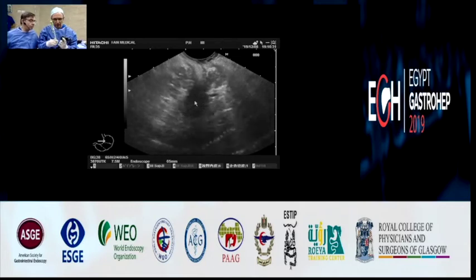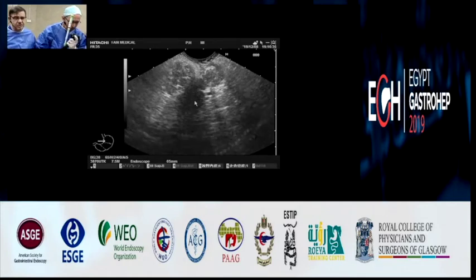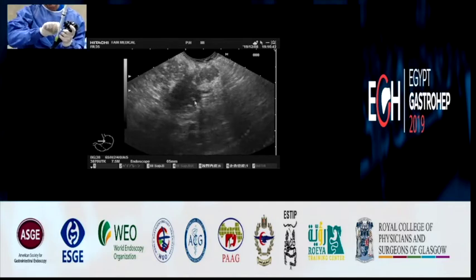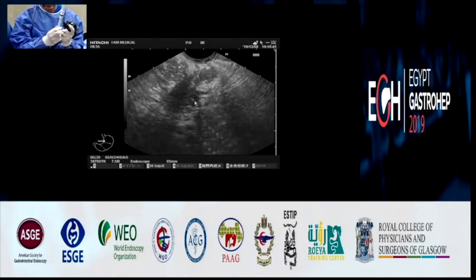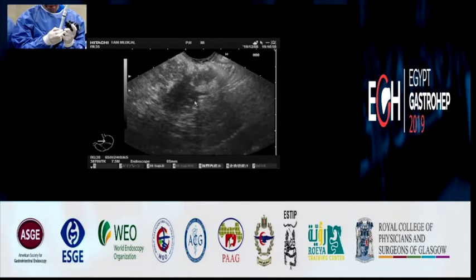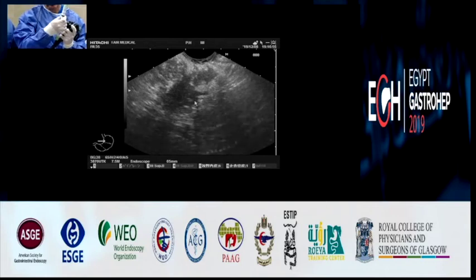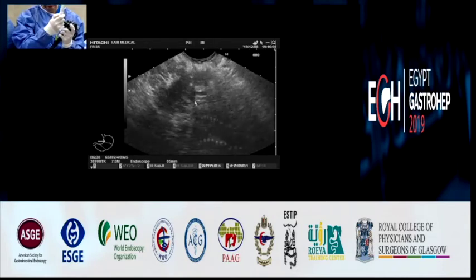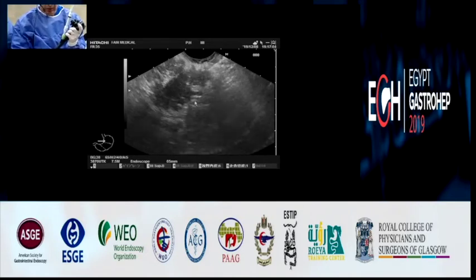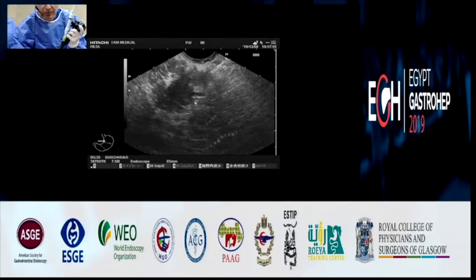One of the signs of autoimmune pancreatitis when there is a mass is that the pancreatic duct is not dilated. There are some published cases of a pseudo-tumoral mass with a double dilatation, but this is very rare. Mainly, one of the main signs is so-called ductitis, the inflammation of the wall of the main pancreatic duct, and the duct is quite not visible on the EUS, and very thin on the MRCP. Okay. Thank you, Mark.